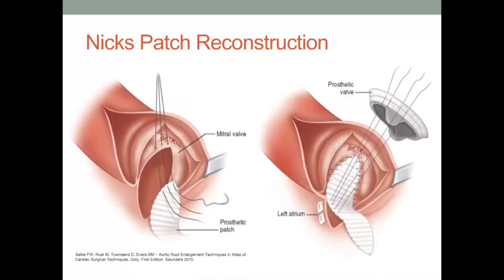If the Nix incision is carried further into the left ventricular outflow tract by crossing into the anterior leaflet of the mitral valve and onto the left atrium, reconstruction is initiated by placing the patch into the deepest portion of the incision and in turn reconstructing the defect within the anterior leaflet with patched material. Interrupted sutures without pledgets are suggested for accuracy and strength.